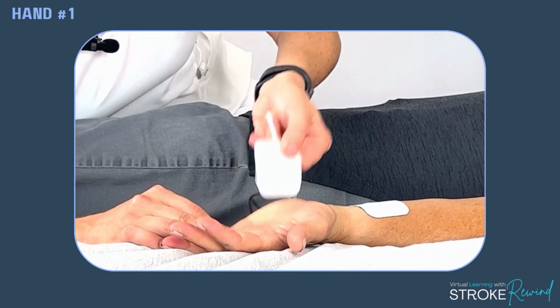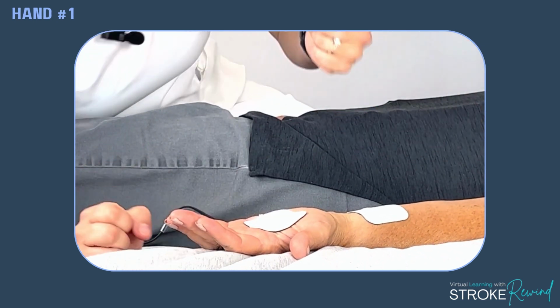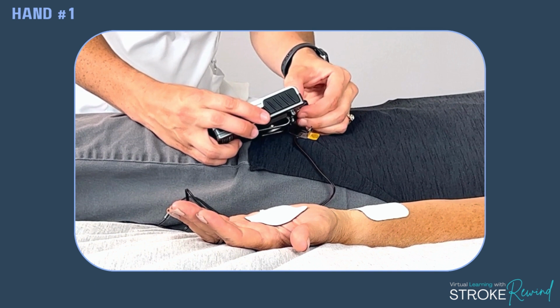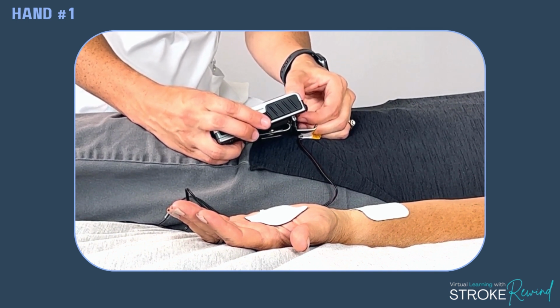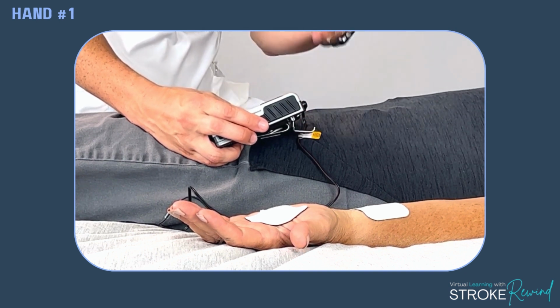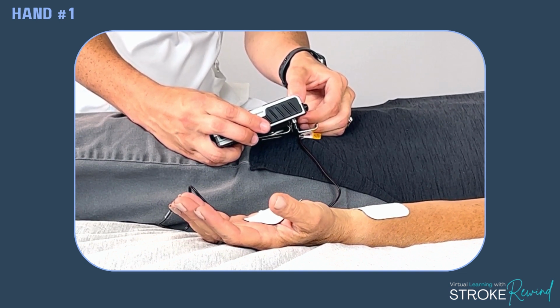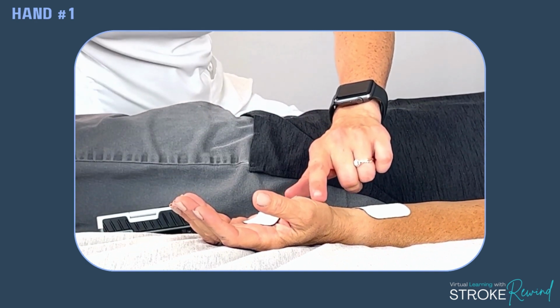I'll show you, for example, the front, the pad of the hand, and what we're hoping for is just a movement in the fingers. So to start, I am going to turn on the machine. Let me know when you feel it. I can feel it. Okay, now that she said she can feel it, I'm going to move forward and see if I can get the hand to move. All right, now are you moving your fingers at all? No. Does it hurt? No. See how we're really getting a lot of thumb, right? A lot of thumb movement.